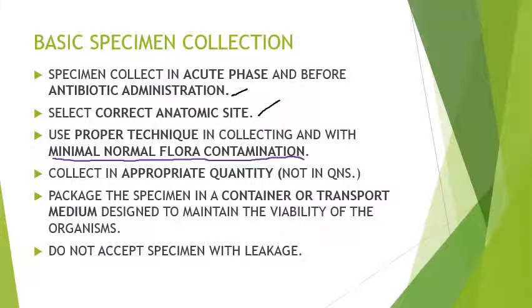Example, during the throat swab, like we actually do in the laboratory, we need to have minimal interaction with the saliva. If there is saliva contamination, then there would be more normal flora than the actual bacteria that we wanted to isolate. So mas marami pa tayong makukuha na mga normal flora na hindi clinically significant. Kasi we know that in saliva, we can see many bacteria.